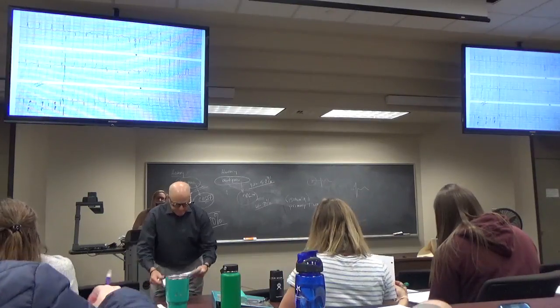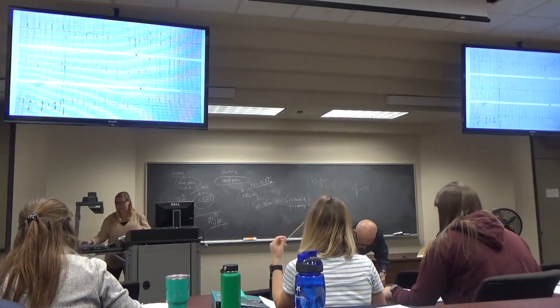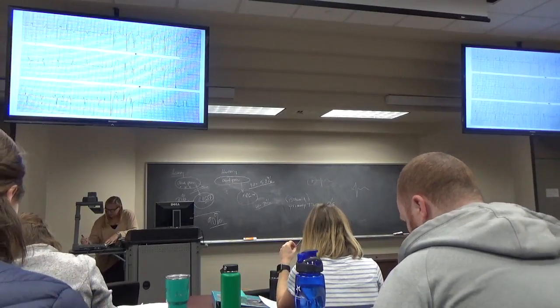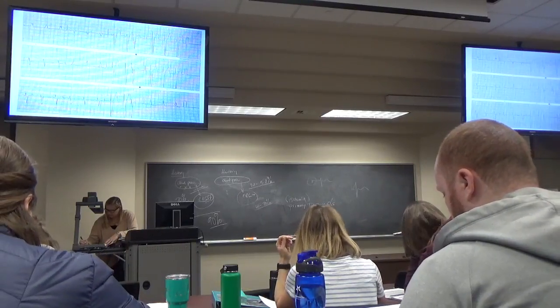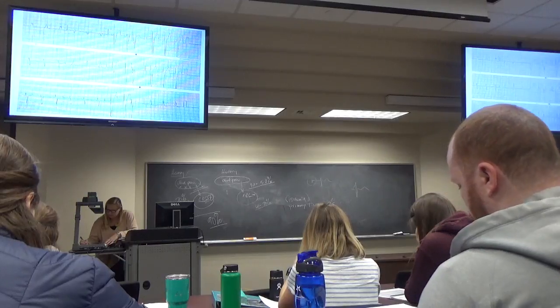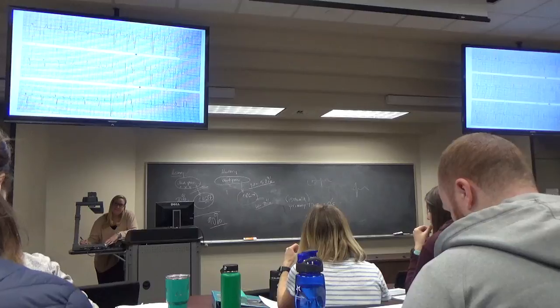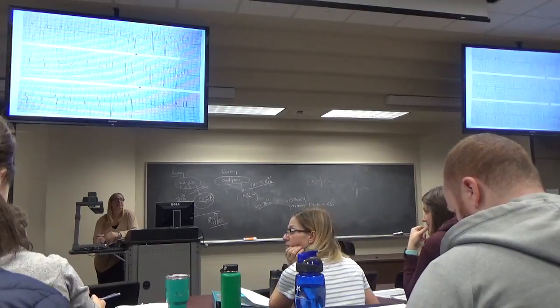13. Bailey. I put sinus rhythm, but then I saw that in V1 through V3 it was abnormal, so I didn't know what I should put. So what defines a sinus rhythm? P wave before each QRS. Okay, or I guess it being a normal rhythm rather than irregular. So don't worry about normal. Don't use the term normal on this unless you can't find anything wrong with it, then it's a normal EKG.